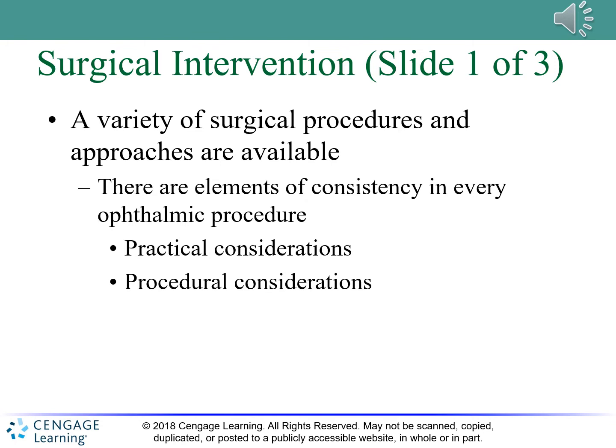And then under the procedural considerations, that second one, periodically irrigate the eye using a syringe or small squeeze bottle filled with balanced salt solution or BSS to prevent corneal drying. And again, that BSS is an irrigant used for the eye during eye procedures. We have a bottle of it in the lab just in case somebody gets something in their eye. We do have BSS in the lab.